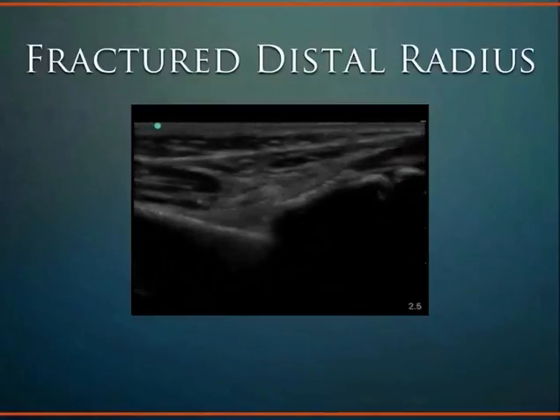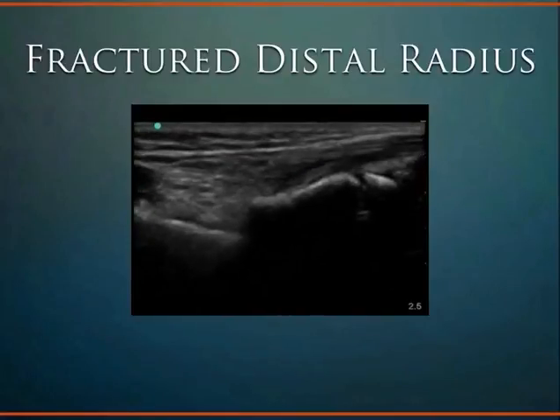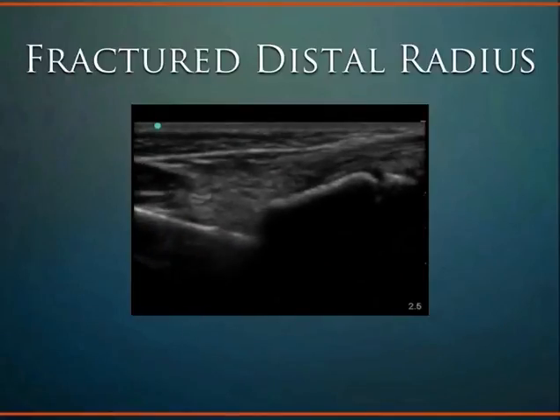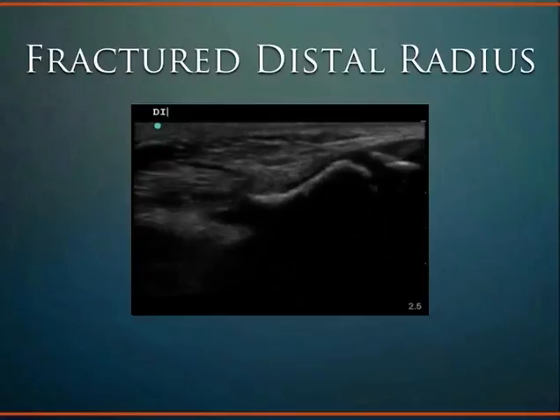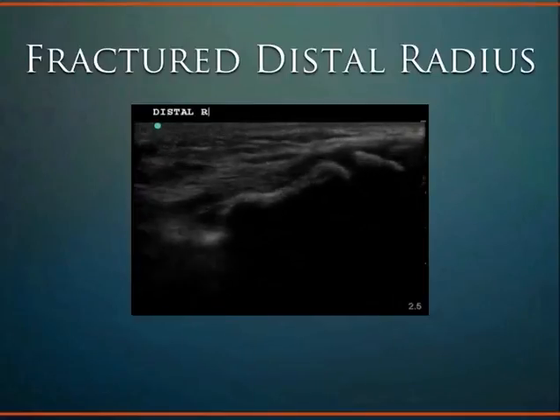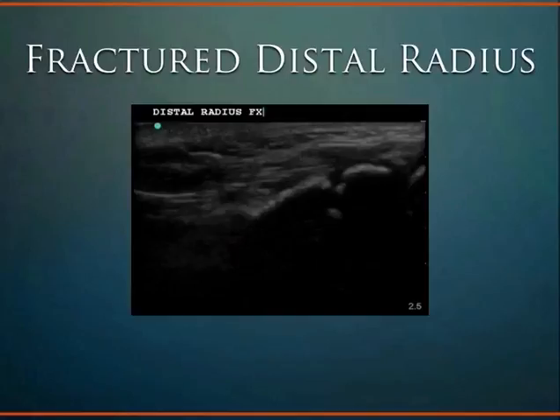Is it really painful for the patient to ultrasound a bone fracture? Not so much, and you actually use the site of maximal tenderness as a guide to where to image on the bone as your protocol to find it. In different regions of the body, you do have to put a little pressure. But most of the time, especially with these forearm bones or bones that you're typically going to image for fracture visualization, you don't really have to push that hard. You just place the probe on the surface of the skin, and there typically tends to be a lot of fluid collection and hematomas in association with fractures. As we know, water and fluid help the penetration of the sound waves, and so the hematoma actually helps a little with visualization of the actual fracture. So you don't have to push that hard. You find that maximal point of tenderness and then visualize there.